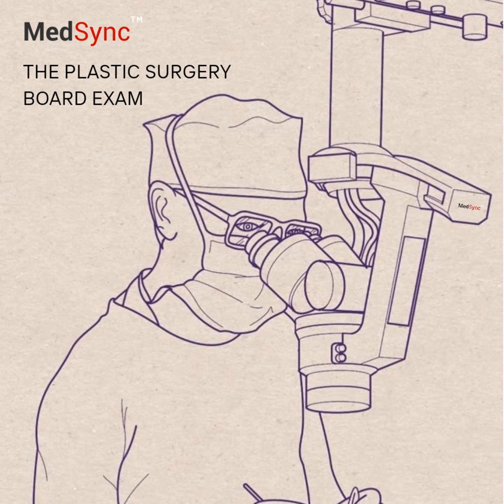What about using lasers for scars? For scars, particularly erythematous or hypertrophic ones, the target is often oxyhemoglobin in the small blood vessels within the scar. So, similar to vascular treatments? Somewhat, yes. Lasers like pulse dye, 585-595nm, or Nd:YAG 532 and 1064nm are used.